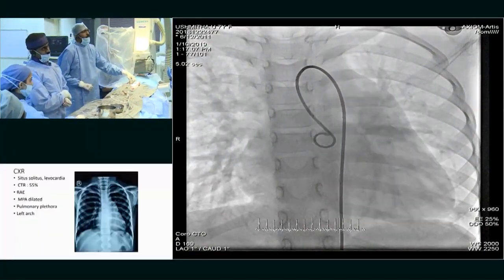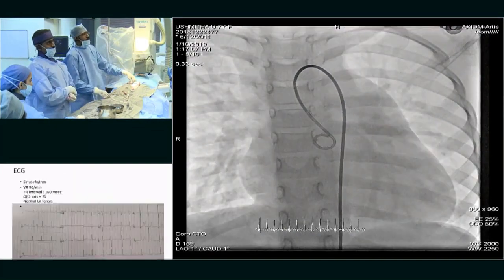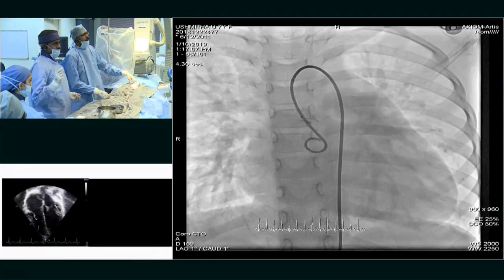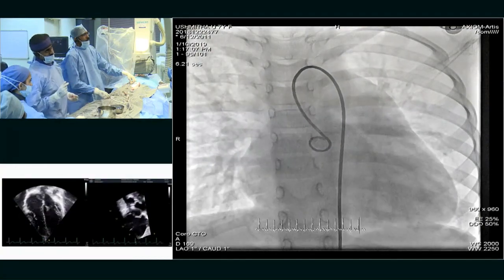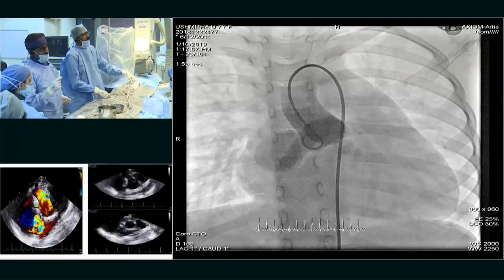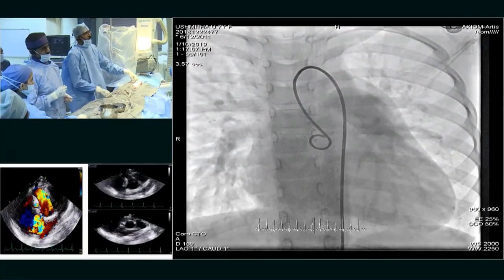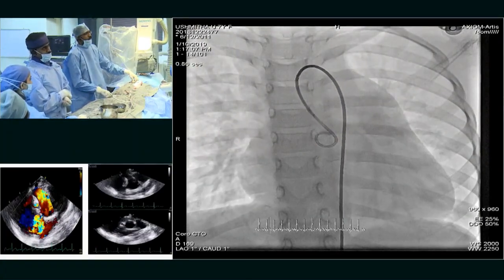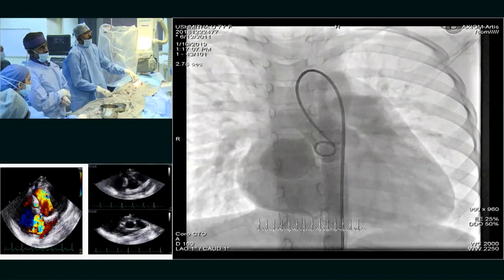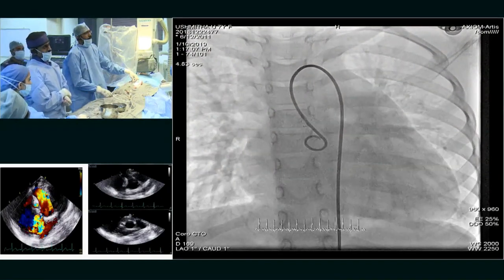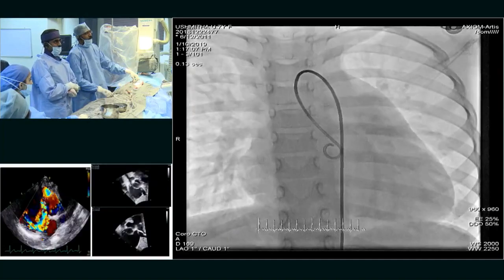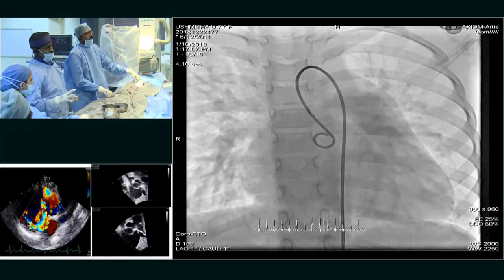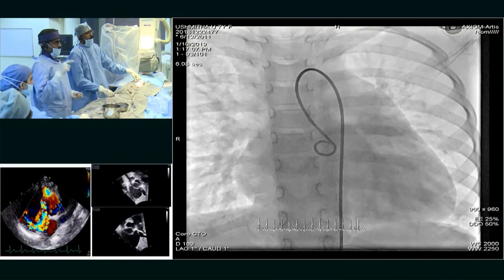The fistula was arising from the right coronary artery. The tunnel on the echocardiography and CT scan was around seven to eight millimeters in diameter, and then it became an aneurysmal two-and-a-half to three centimeter segment on the posterior part, lying within the intra-atrial septum, taking an exit into the right atrium. To cut short the time, I am not showing the CT or echo — going live with the fluoro.